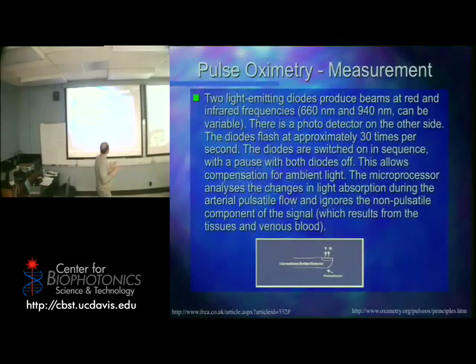Okay? Why do you do this? You want to do this because if I've got that pulse oximeter and I'm out in the bright sunlight, guess what? Some light's getting in at those wavelengths and making it to the detector. Because you remember what happens when the light gets in and it scatters all over the place? Okay? It's getting to the detector. You want to be able to subtract that out. And because, again, you want to make this device cheaply, you've only got one photodetector.